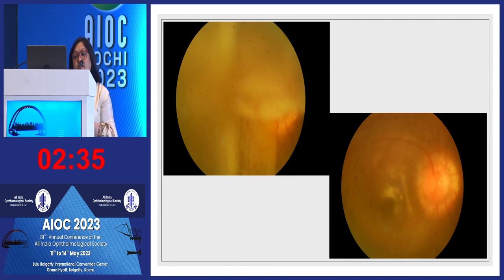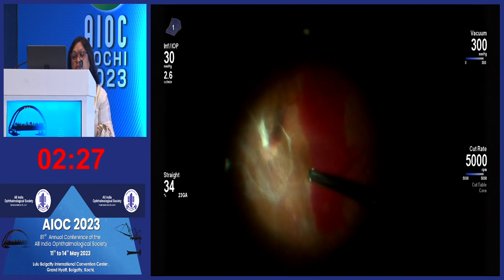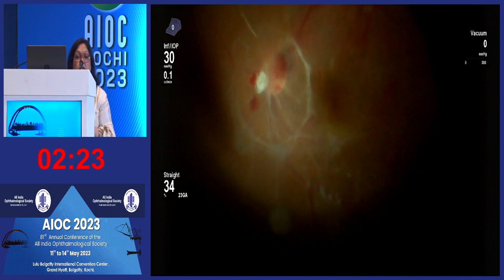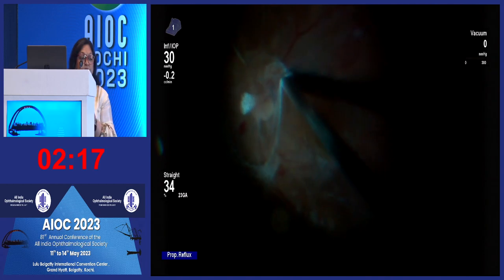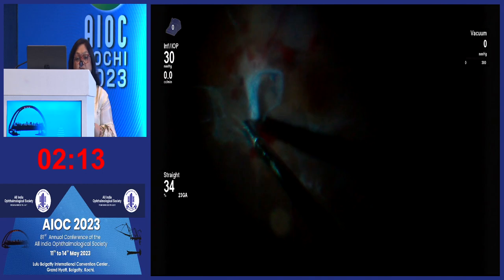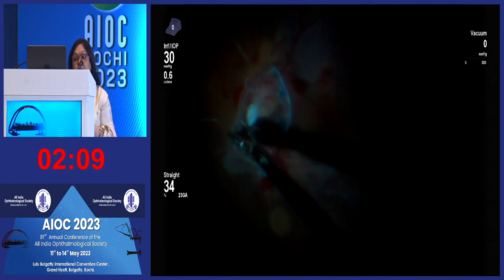My second case is a case of bilateral PDR with a very similar kind of fibrous proliferation right at the disc. And you see the entire prolif just sitting around the disc with completely sclerosed vessels. So yes, you can pick up the prolif like that also, but I would like to stain it with a blue dye so that I can get an edge. A proportional reflux in the Alcon Constellation machine is very helpful in such cases to create a plane.